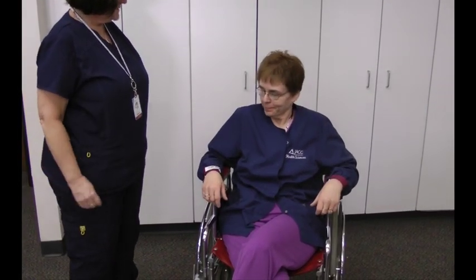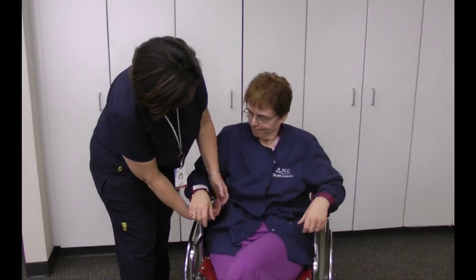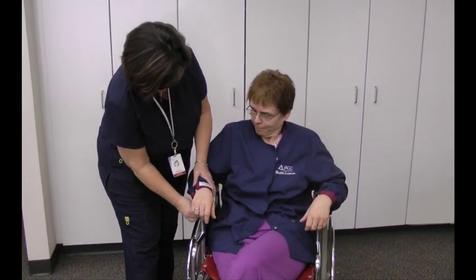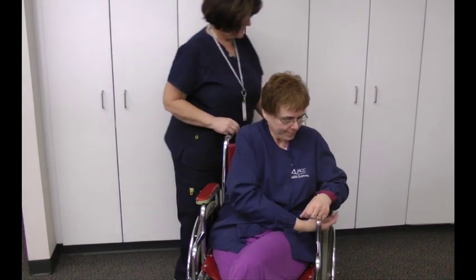Have you seen one of these recently? No. I have not seen a wrist restraint in a long time. Again, it's one pull, and it releases real fast. More in the hospital.